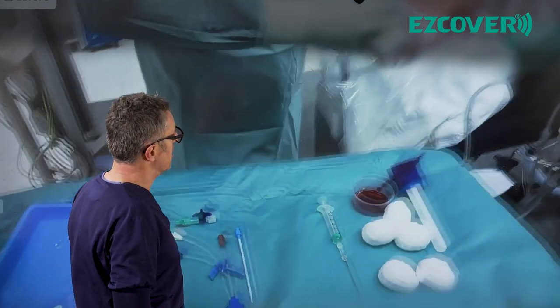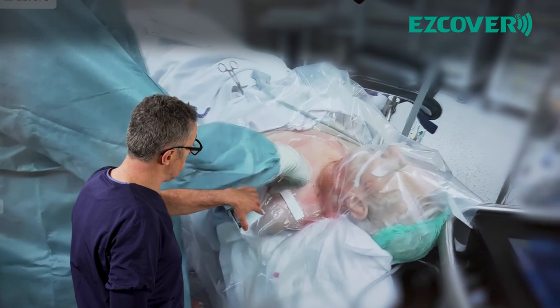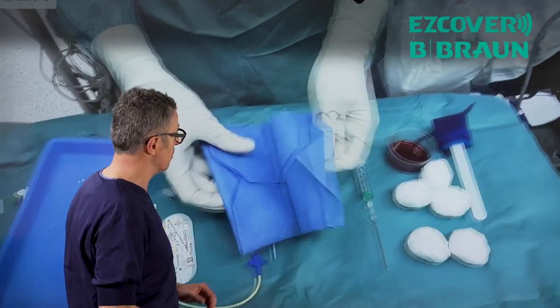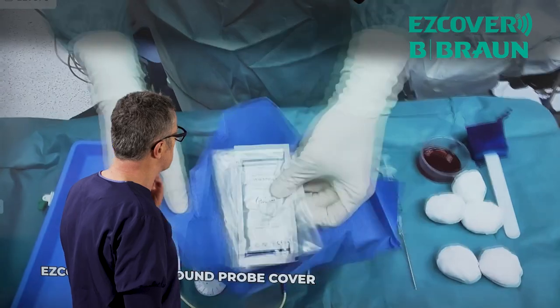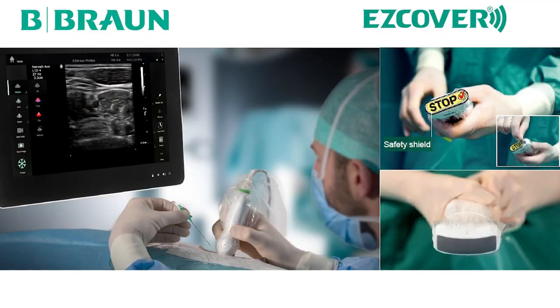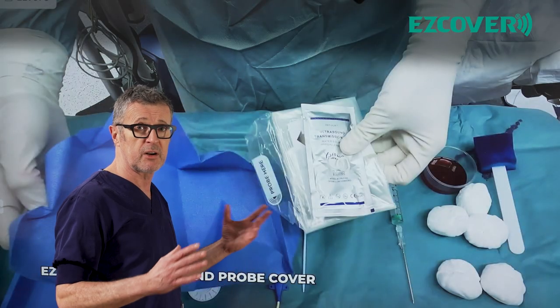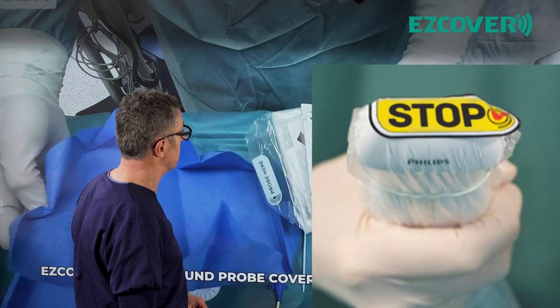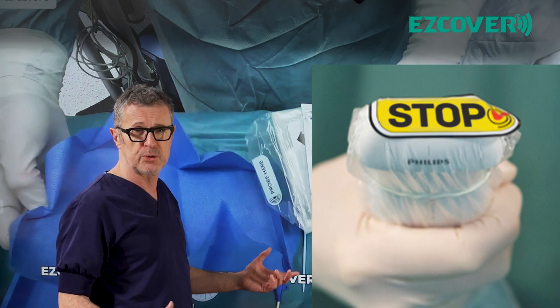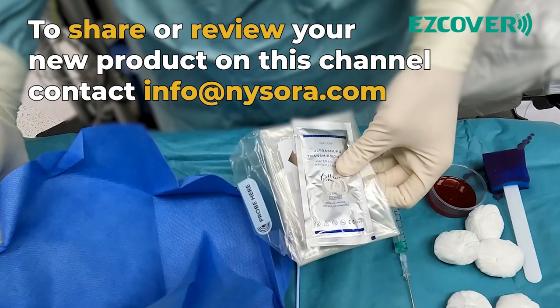Having the guide wire immediately available in the pocket really makes a big difference. So now that's the guide wire — we're going to prepare it inside the pocket so we don't have to look for it. Here's another advancement: these are the easy covers, ultrasound probe covers made with a second-skin kernel material with very clear labeling as to what goes where and one additional feature to make sure we don't perform a procedure on the wrong patient.